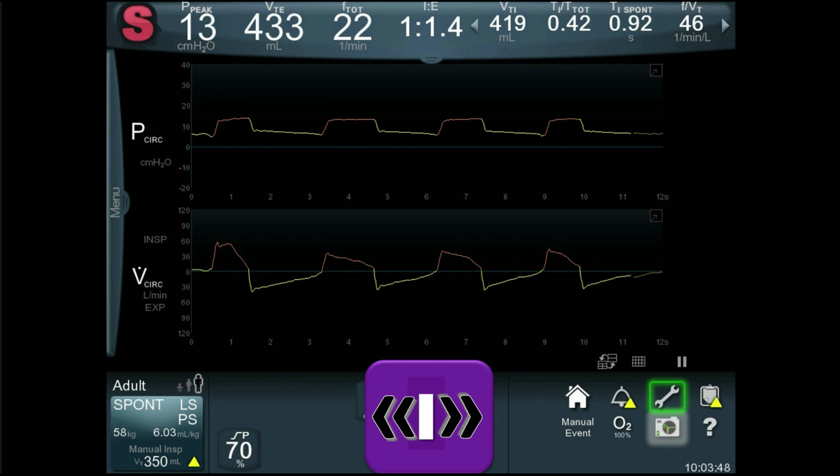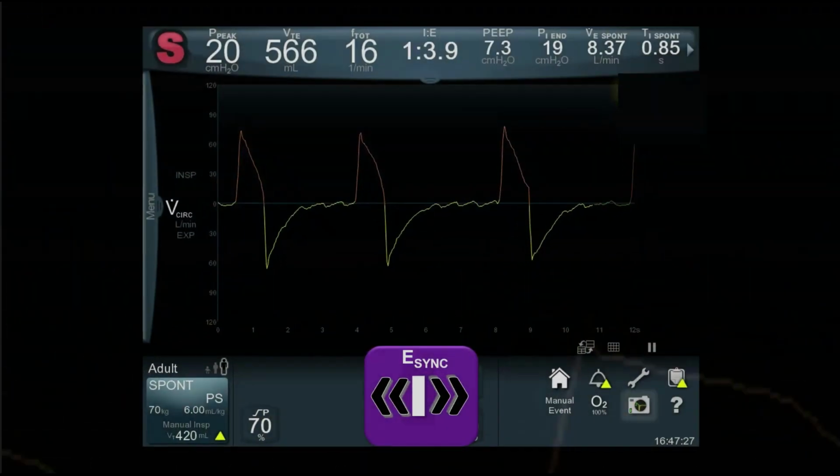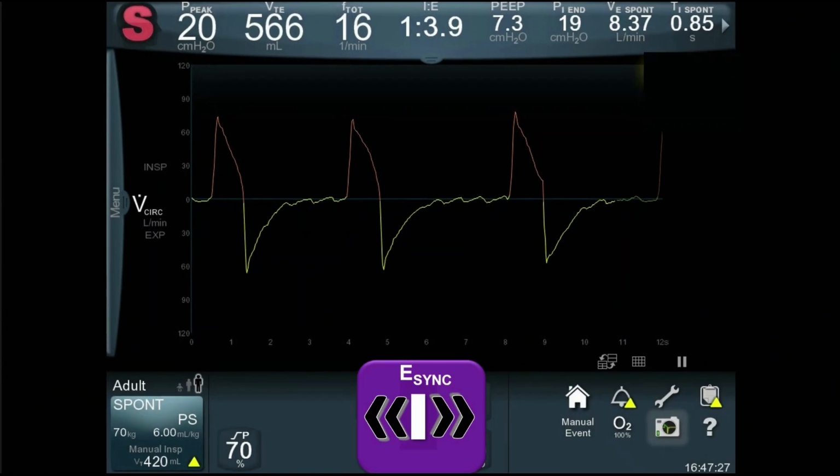As in this particular case where we put it on a patient, immediately it just looked perfect. So this patient settled down really, really well without any further adjustments. And you can see the flow waveform is very pretty. Now, it is worth pointing out that if you see this flow waveform, it's very different from what you've seen on pressure support versus volume support. The flow waveform is red, but it doesn't curtail at a particular percentage of peak flow. In fact, it goes all the way down to baseline. It doesn't shave off, and this is a peculiarity to this modification, and that's part of the whole paradigm. Flow ends when the breath ends. It doesn't have to predict when the patient is exhaling.